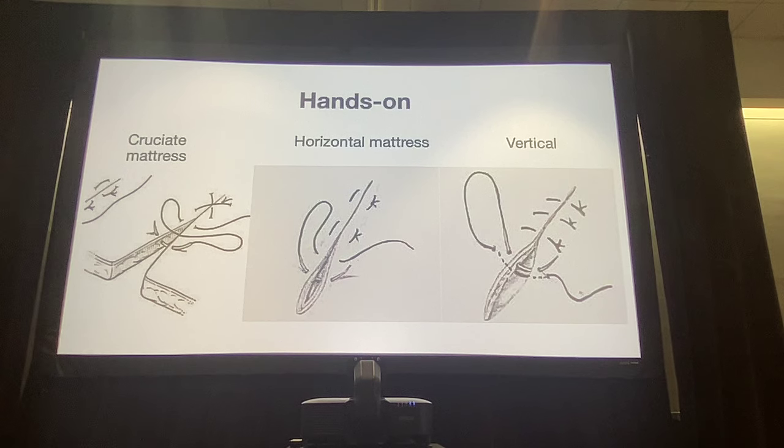Instruments, they can put their hand in there and not have to deal with a cumbersome instrument. I will tell you though, being a surgeon, I usually have really long instruments that I use for thoracotomies or whatever, so I get spoiled with it. Depends how often you use that stuff. The only time I use instruments that long is deep liver surgery or gallbladder, or honestly, most often thoracic, like subtotal pericardectomies or lung lobectomies.